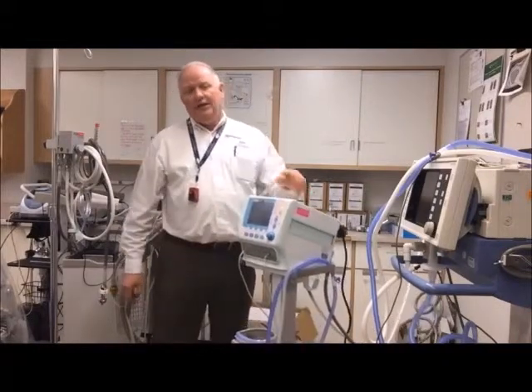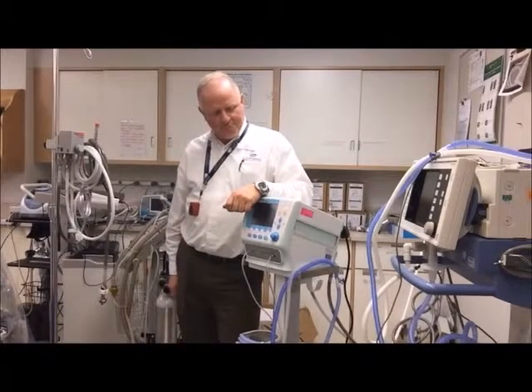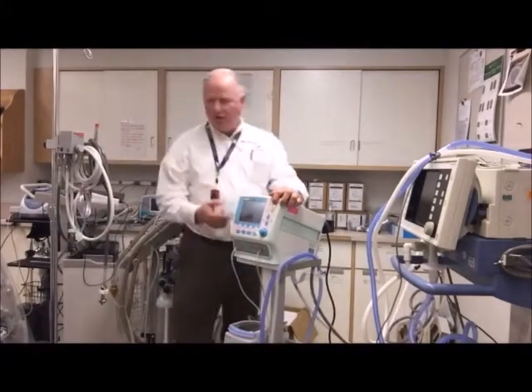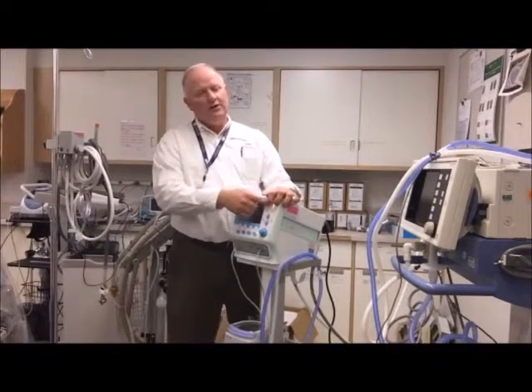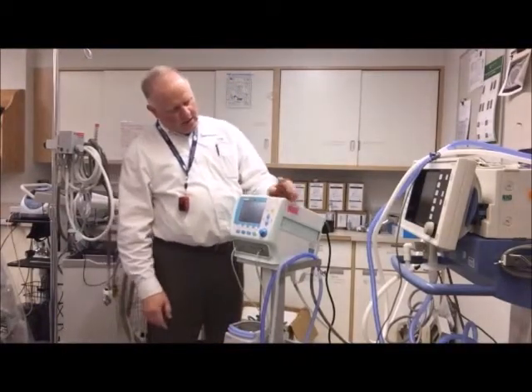It is battery operated, so you can have up to three hours of battery life. We'll go through these buttons — this is your power indicator. If I unplug it, it'll move over to this indicator, and there'll be a yellow light. If the battery gets too low, it'll turn red or flash red.